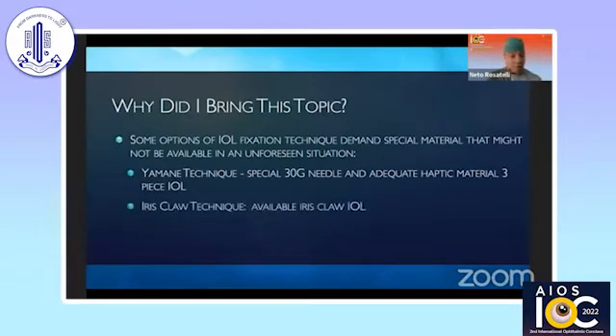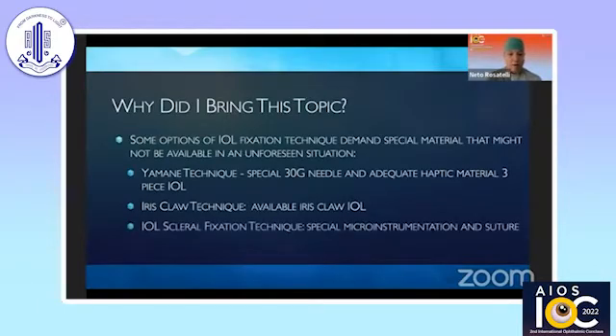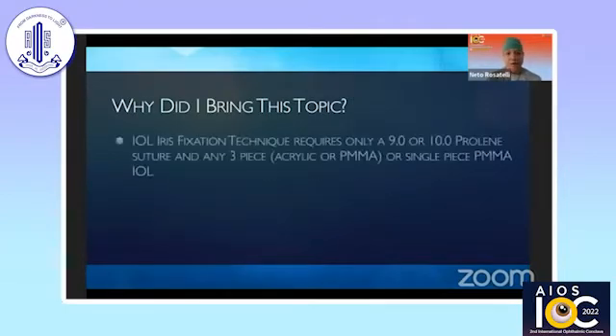The iris claw technique, of course, requires an available iris claw IOL in the proper diopter power. And IOL scleral fixation techniques sometimes require special microinstrumentations and special sutures. On the other hand, IOL iris fixation technique requires only a 9-0 or 10-0 prolene suture, and any three-piece acrylic or PMMA or single-piece PMMA IOL will do.